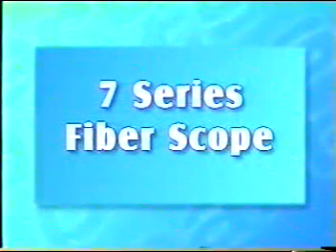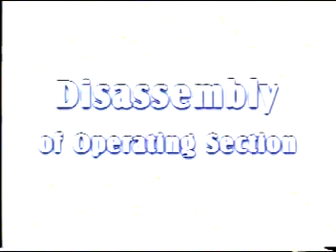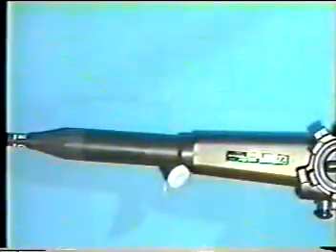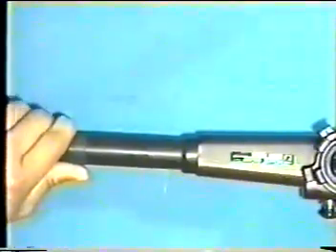When disassembling a fiber scope, pay attention not to damage outside parts, break, and lose parts. How to disassemble operating section. First of all, remove the forceps channel valve.